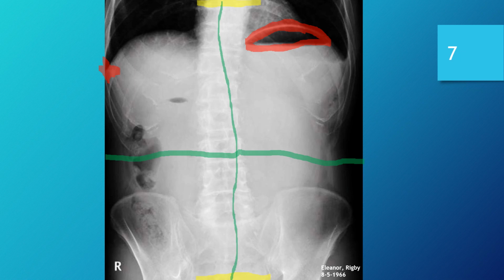Now my line's not really helping us a whole lot here, but I can tell you that in terms of the mid-sagittal plane, the patient is shifted just slightly to the right. Unfortunately, it was enough to clip that lateral aspect of the lung there and that portion of the diaphragm. But to correct that problem, shift the patient back to the left just slightly, and they'll be properly aligned to the mid-sagittal plane.